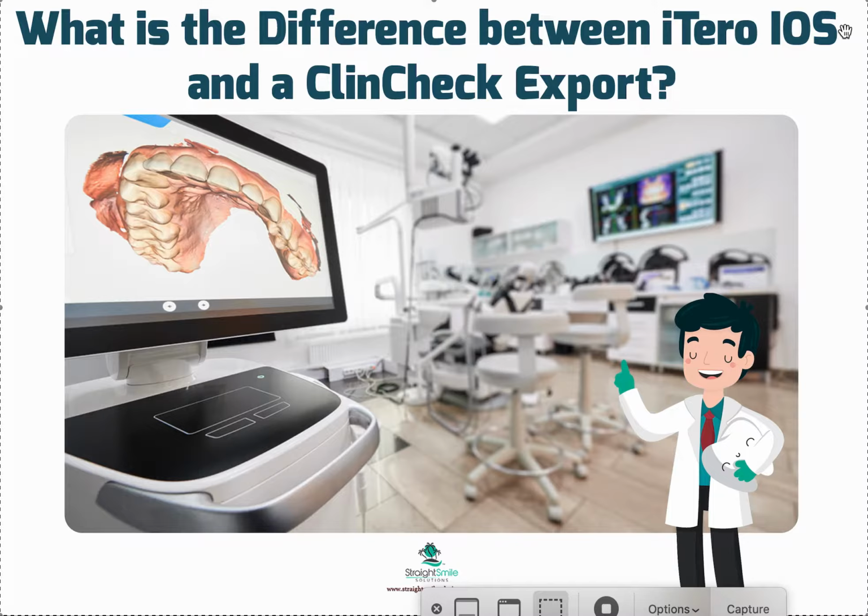It doesn't mean it's exactly what your doctor's gonna do, or exactly how many aligners it's gonna be. It's just a rough estimate. Kind of pretty, right? That's something you get at that appointment. That's completely different from a ClinCheck.